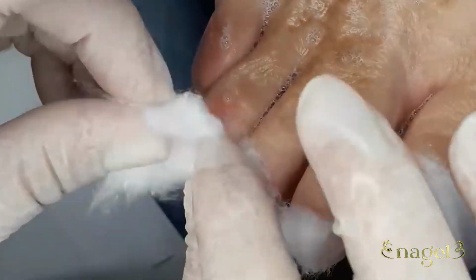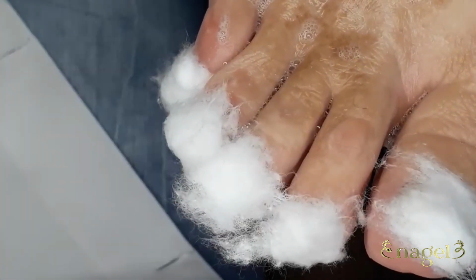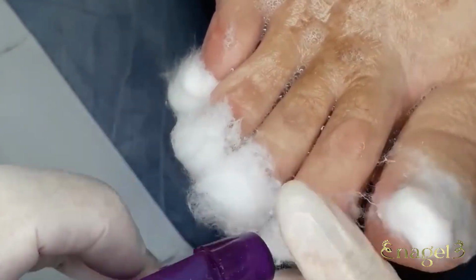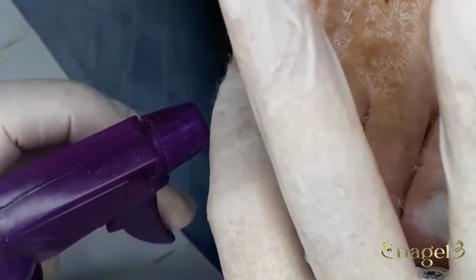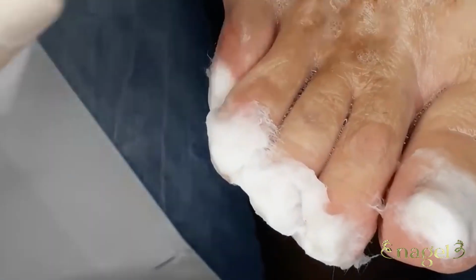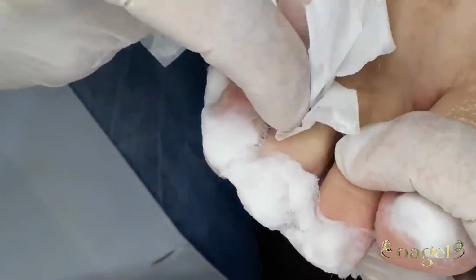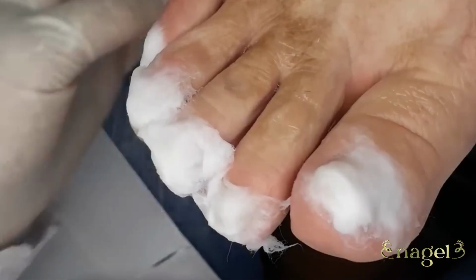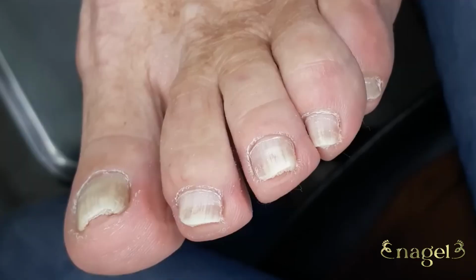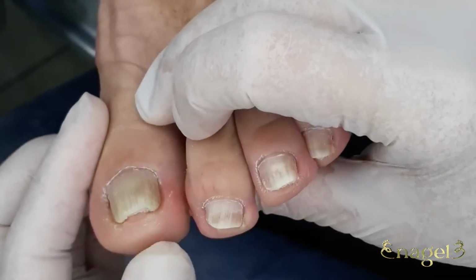First, I begin with a thorough cleaning. I use a sterilized spatula to remove any dead tissue or excess cuticle around the nail. This is essential because accumulated cuticles can worsen the pressure and even lead to infections if not addressed. As I work, I notice the skin around the nail is slightly red, indicating that the nail is indeed causing irritation. My mom said the pain started a few days ago, which concerns me because an untreated ingrown toenail can progress to a more serious infection, like paronychia.